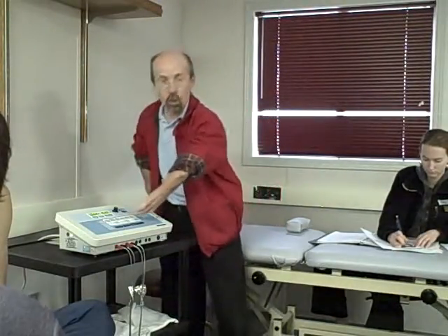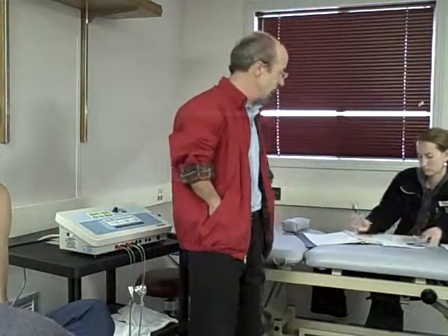Okay, Russian, again, we don't even need to keep pushing all the buttons. Russian is great, very efficient at eliciting a muscle contraction. It's all about muscle re-education, strengthening from a deconditioned or weakened state. Russian goes back to the Olympics in the 70s where the Russian athletes were using it. Will you repeat Russian one more time? So Russian is very efficient at eliciting a muscle contraction. So if that's your goal, you do want to strengthen, re-educate. It's a teaching tool. If that's your goal, then there's nothing like Russian.